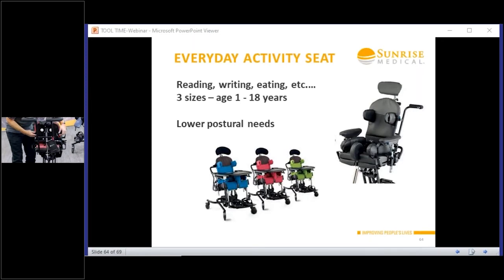So you can see you've got your backrest adjustments there. It's going to give that on these hand wheels, the same as the PAL, so it's giving that limitations. The same thing as hand wheels for the. Oh, sorry. He's moving too quickly. I'm slowing him down, everyone. Hand wheels on the thigh guides as well. So it's just going to give you that outer thigh, give the support, and the same.